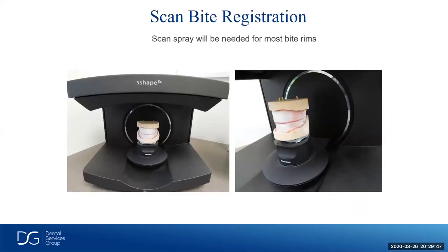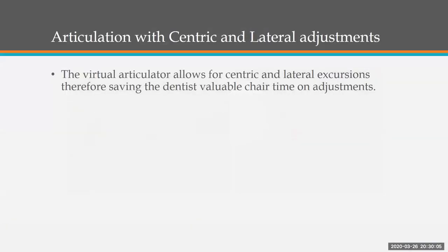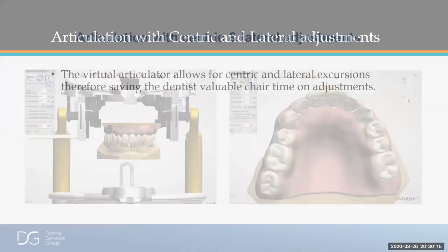What I do is I'll set these models up on a fully adjustable or semi-adjustable articulator, and it's a magnetic type articulator. I'll put this in the 3Shape, I'll spray it with some scan spray, and the 3Shape scan will pick up all the information I need, with midline, cusp lines, bite registration, and all that will be put into the software. And the articulation with this 3Shape software, the virtual articulator, allows for centric and lateral excursions, saving the dentist valuable chair time on adjustments.